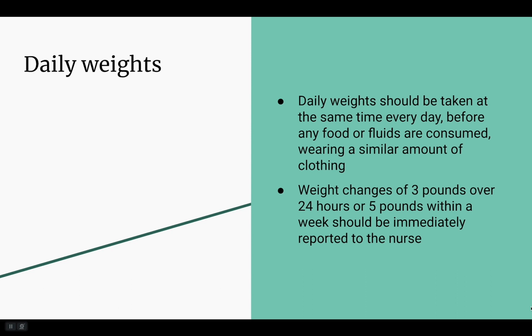A skills checklist can be found at the end of this module regarding measuring weight for ambulatory residents.